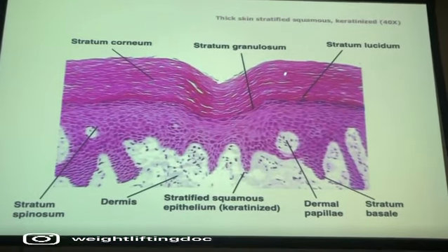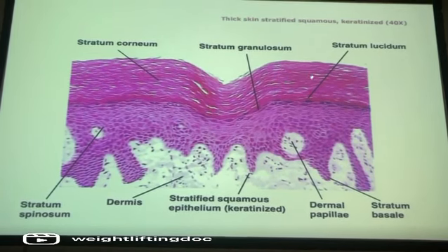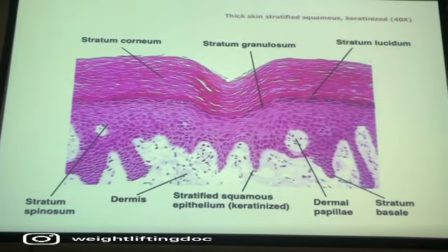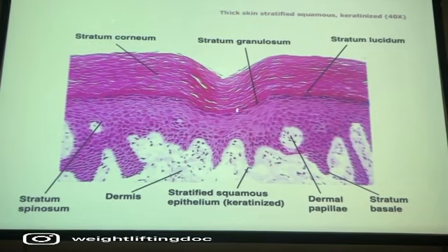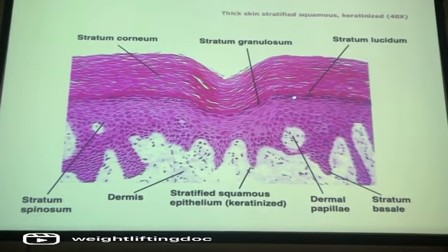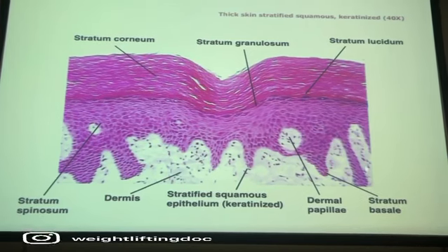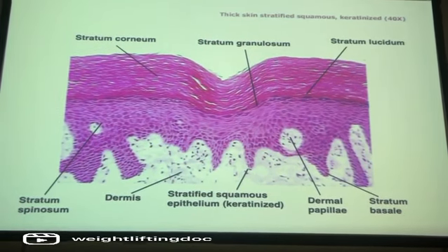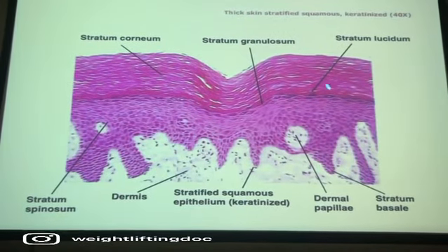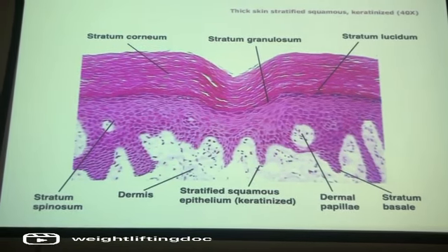If I know I'm on the outer layer, okay? Now, tissue, we're talking stratified squamous, and we know it's keratinized because it's skin. But if I'm talking about layer, pay attention, because layer, then we're talking stratum corneum on the outside. Okay? I don't love stratum lucidum on this one, but it's right underneath. And then this purple is going to be stratum granulosum, which makes this spinosum, and the very bottom layer, stratum basal. Not as clear as some of the other slides, but the outside layer and the inside layer we're always going to know. They'll just go to the bottom of it and go to the top area here, right? So those are always indicated.